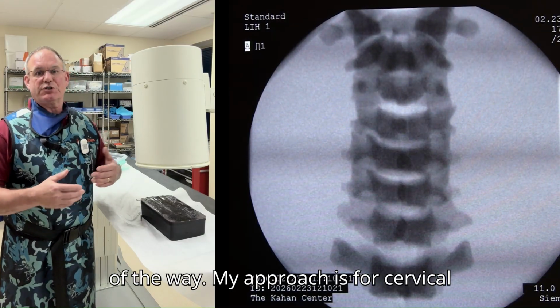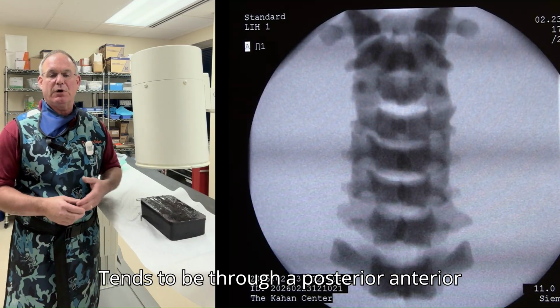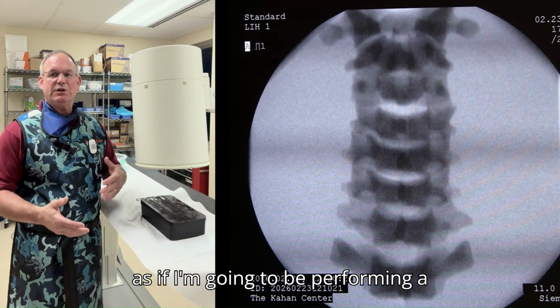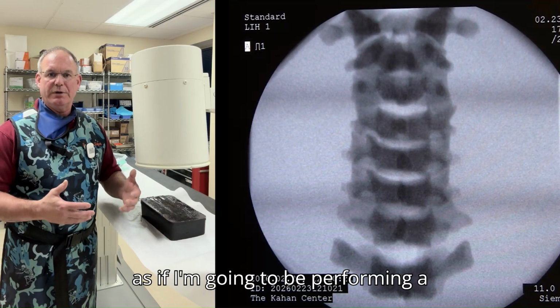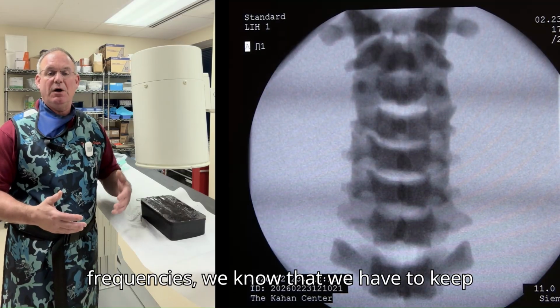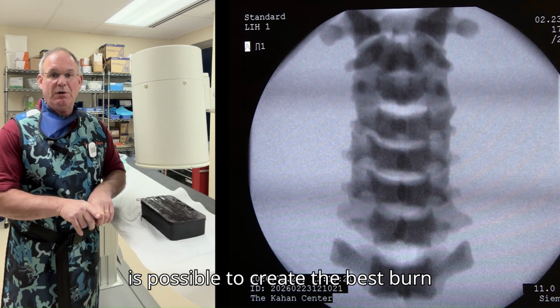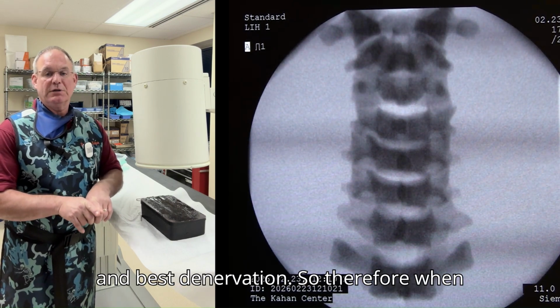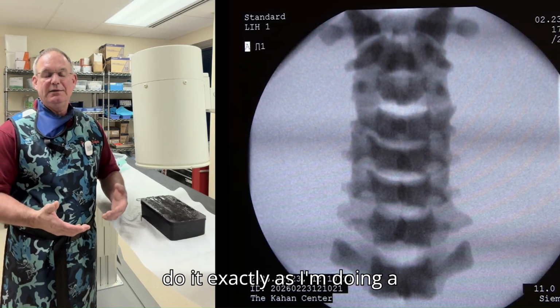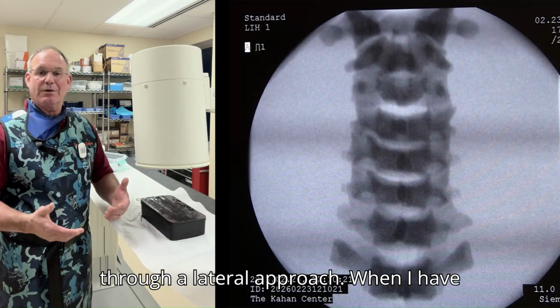My approaches for cervical medial branch blocks and facet joints tend to be through a posterior anterior approach. Although I know how to do lateral approaches, I tend to do things as if I'm going to be performing a radio frequency or setting up for a radio frequency. When we're doing radio frequencies, we know that we have to keep our cannula as parallel to the nerve as possible to create the best burn and best denervation. So therefore, when I'm doing a medial branch block, I do it exactly as I'm doing a radio frequency, as opposed to going to a lateral approach.